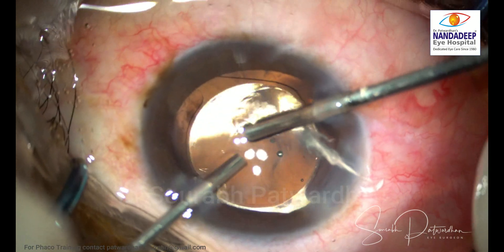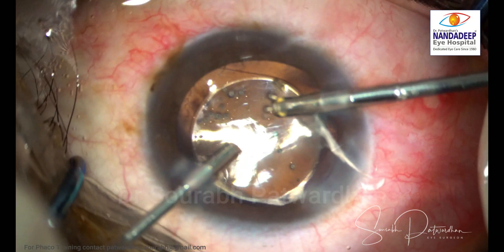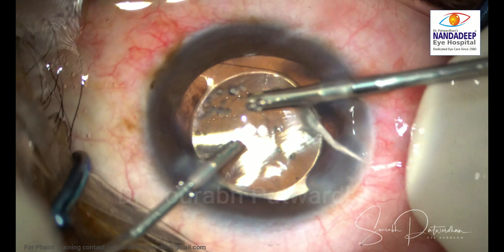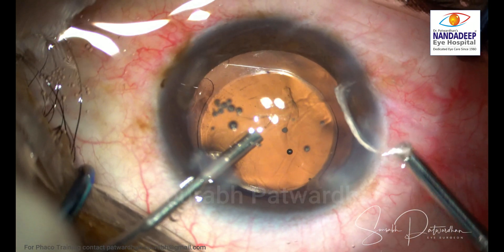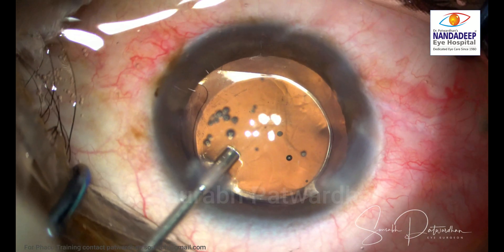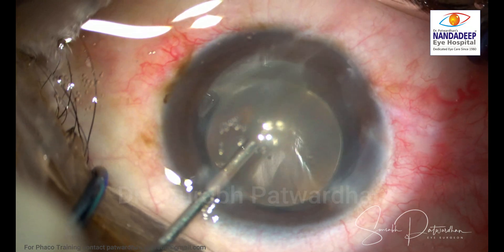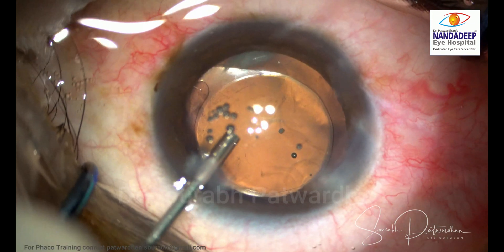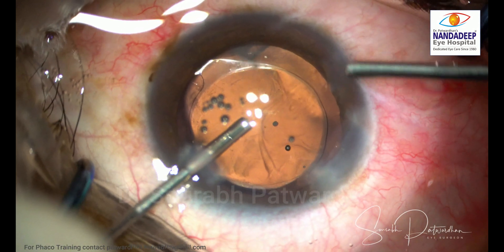I am using a 2500 cut rate and 100–150 mmHg vacuum, with bottle height set at 60 centimeters to avoid over-hydration of the vitreous. If the cut rate is good, you do not always need to go through the pars plana route — you can do good anterior vitrectomy and clear the vitreous from the anterior chamber, which is our main aim. A good cutter and cutting of the vitreous from the area of zonular weakness is all that is necessary.